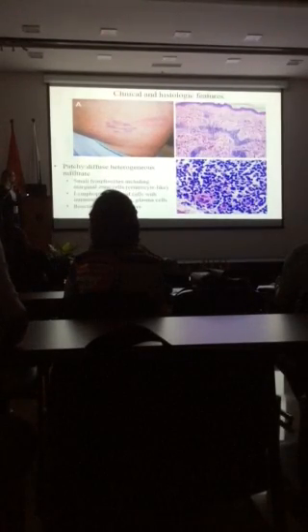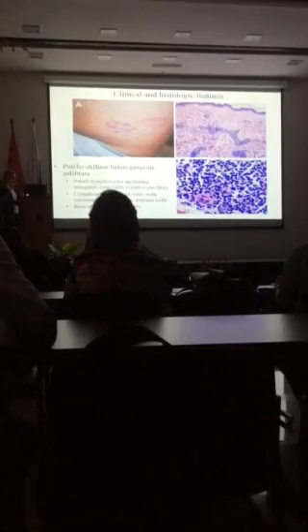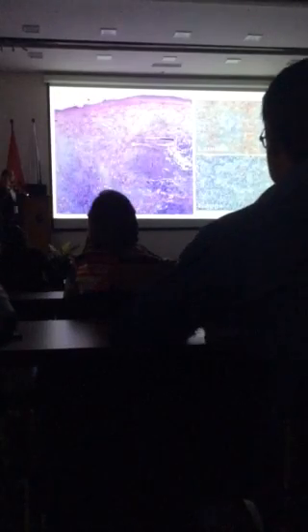There's no angiodestruction or any follicular destruction. You find those cells are pretty small and almost inconspicuous. This is another patient. You find here this patient is lambda restricted, kappa negative.